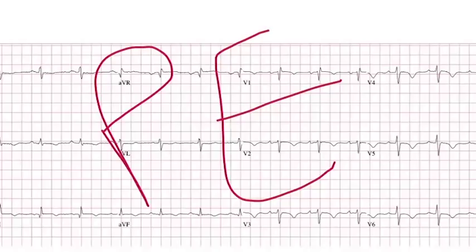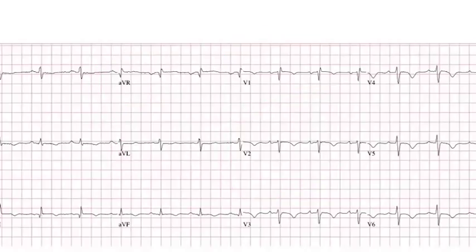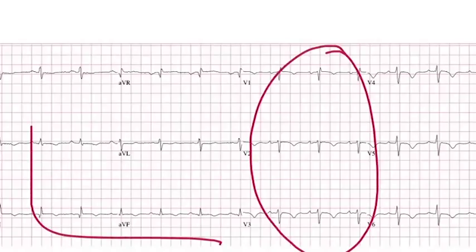This is a sign of heart strain. There's various theories about why PE can flip your T waves. Some people say that pulmonary embolism induces some subendocardial hypoxia and ischemia. Some people say that when you get some ventricular distension, it shifts the axis of the heart, and that can produce some T-wave inversions. Whatever the reasons are, it's very important to remember that when you have new T-wave inversions, for the third time now, when you have new T-wave inversions in the inferior and anterior septal leads, that is acute pulmonary hypertension, which in emergency medicine is PE. If those are old flipped T waves, then it means a person probably has some element of chronic or old pulmonary hypertension.